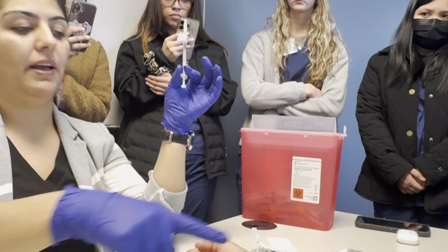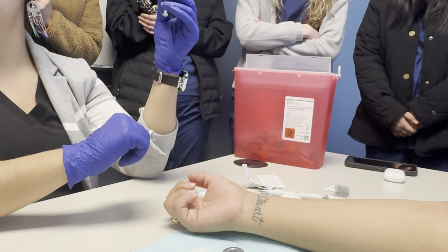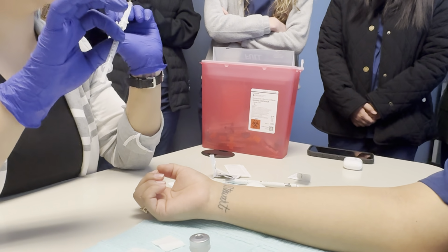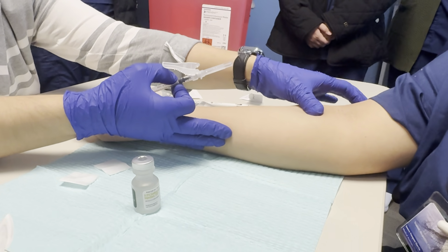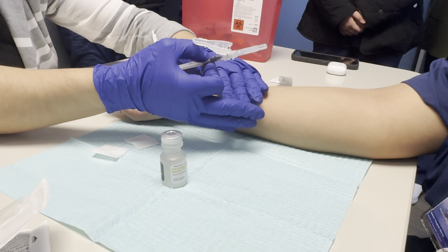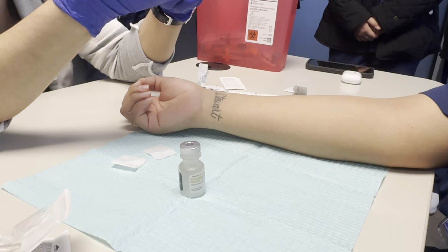Now I'm ready. And since that time, she did not touch it, I did not touch it, I'm ready to go. I don't like doing this sitting down, but I sit because people behind me can see. So I'm going to hold my hand right here, and I'm going to anchor. This is anchoring, guys, okay? Anchoring from top. We don't want to anchor from the bottom, because what was the degree angle we want to go? 5 to 15. 5 to 15.